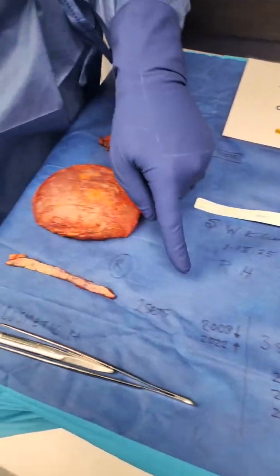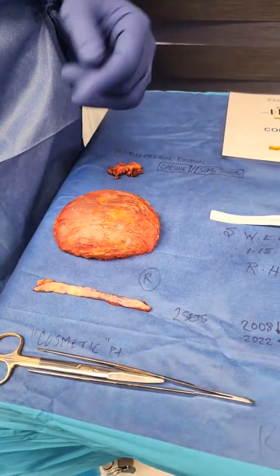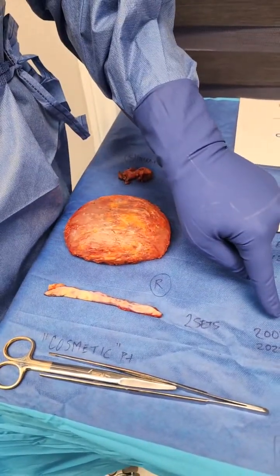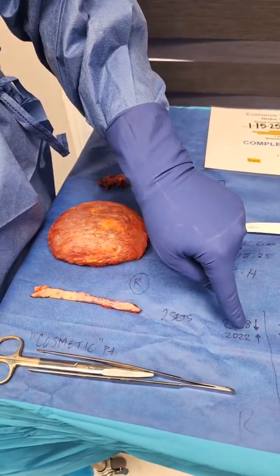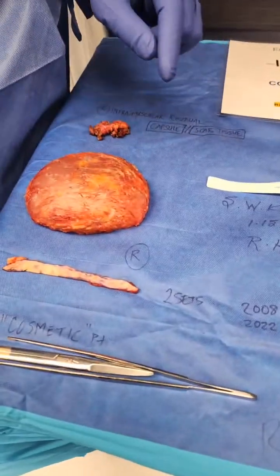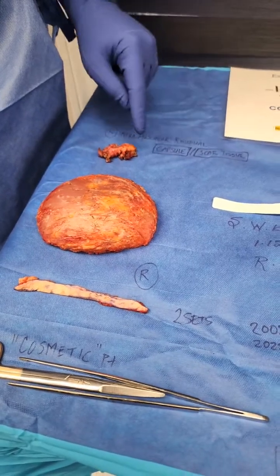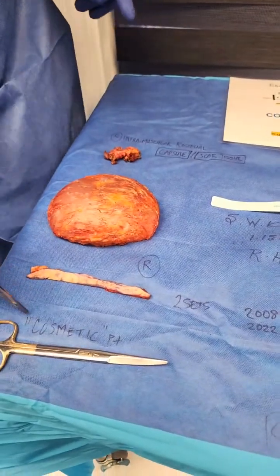On the right side, she is being treated as a cosmetic patient, so she has her own native tissue. And so she ended up getting 2 sets, one in 2008, and this was below the muscle, and in 2022 above the muscle. So the goal today was to remove the right inframuscular residual capsule scar tissue, which is what I did right here. And this is the non-cancer side, the cosmetic side.